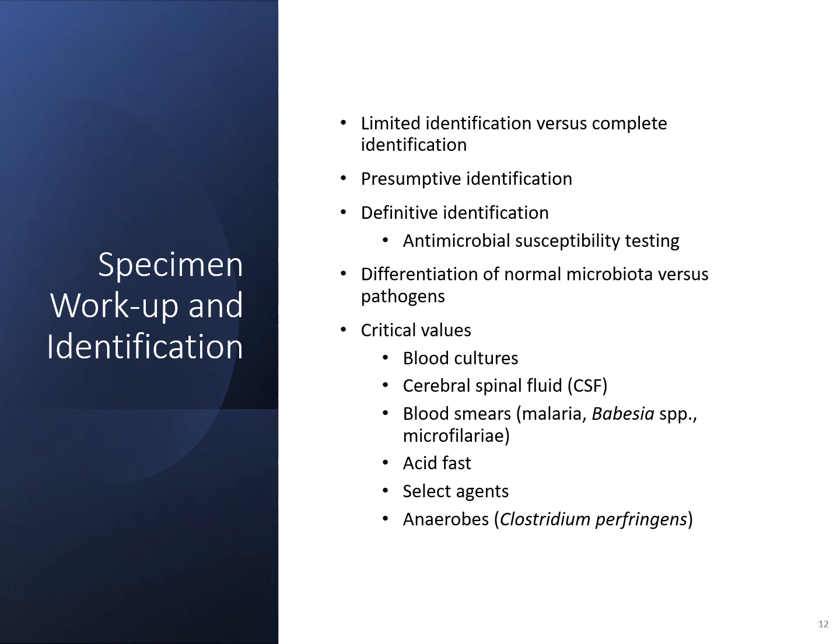With a presumptive identification, you use a small batch of tests and presume an organism to be a particular organism based on those tests. So you're not going to do a complete workup, or it may be a presumptive identification for a preliminary workup before you do the additional automated testing.